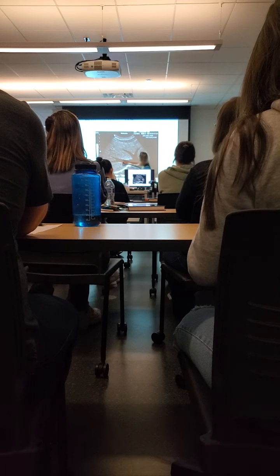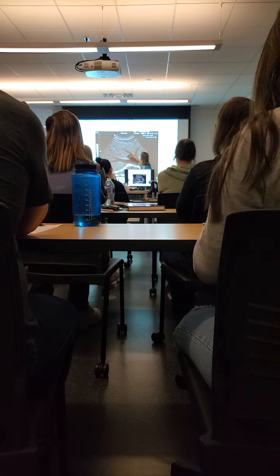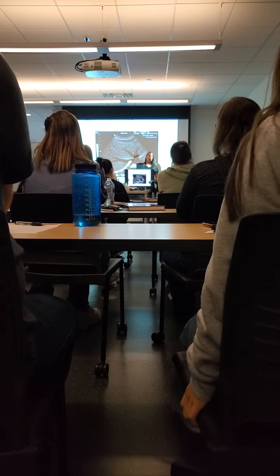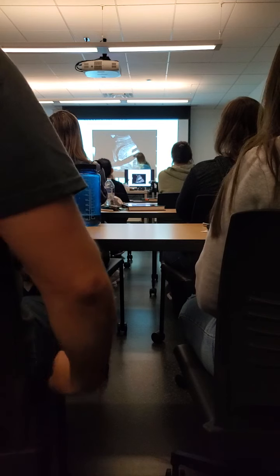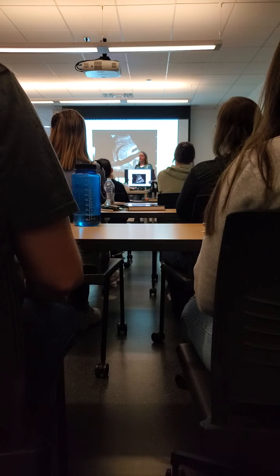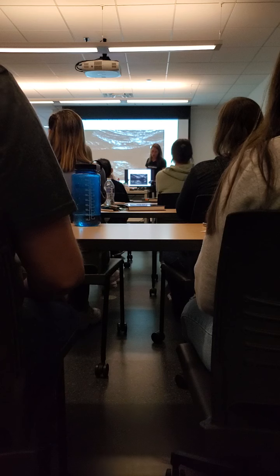Now hepatics don't typically have bright walls, but this one does because it's really flat to our beam. But more often you're going to see that they just have the anechoic walls, and it's the portal veins that have bright walls. More on that later. Hold on to your little heads. All right, here's a middle hepatic. So our IVC is here, right atrium, so superior, inferior, anterior, posterior, and here's our hepatic vein going right into the IVC, getting ready to go into that right atrium. And this is a coronal of the iliac arteries.